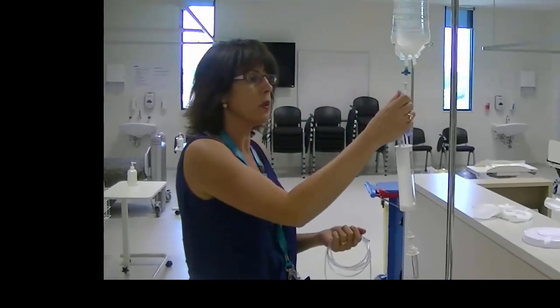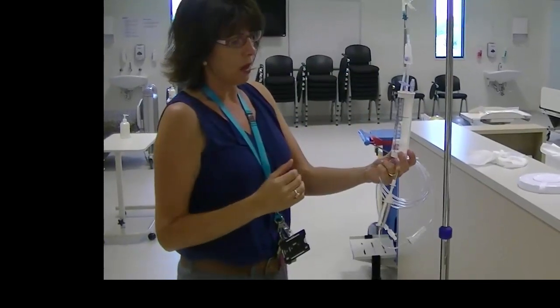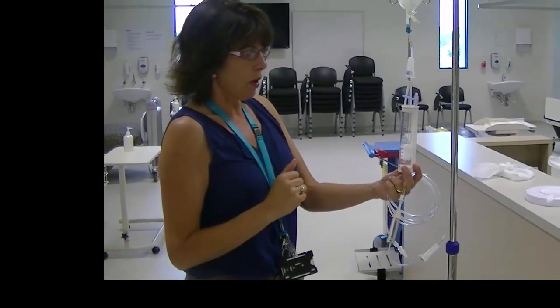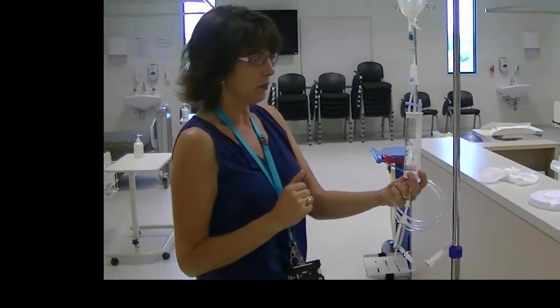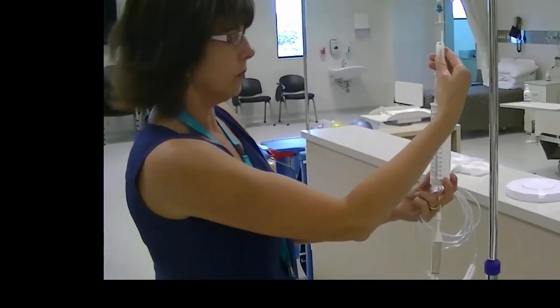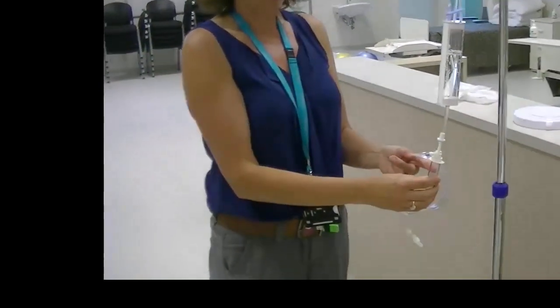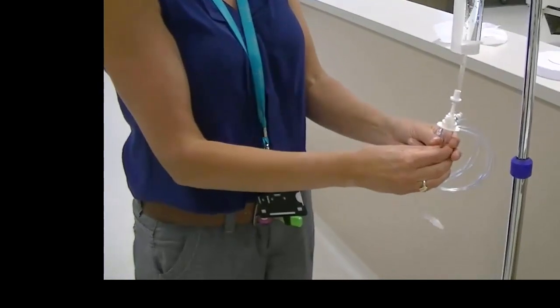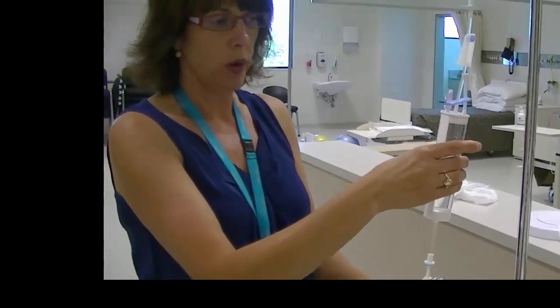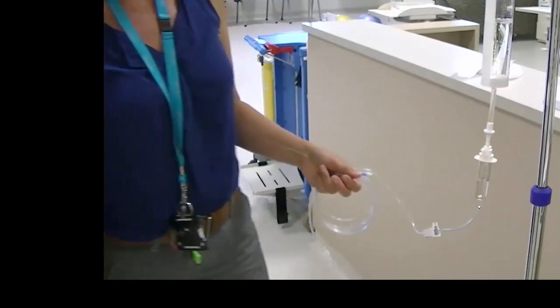Starting at the top. Open up the roller clamp to the burette, and I'll fill it up to about 100 mils because that gives me a bit of room to prime the line. Turn the roller clamp off. Next we have to prime the drip chamber by giving it a couple of squeezes. Do not squeeze the burette because eventually that will crack and then you'll have spillage. Squeeze the drip chamber to about half full.